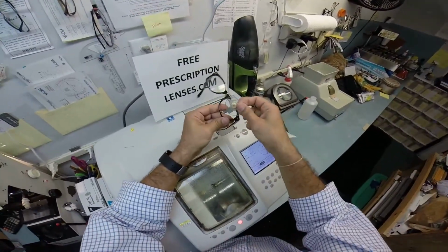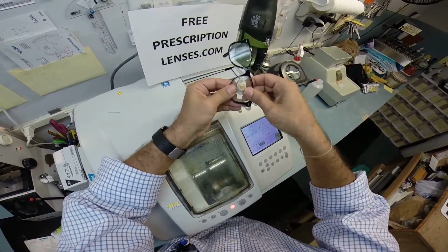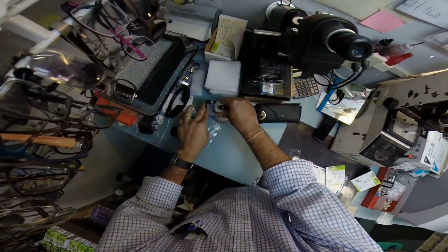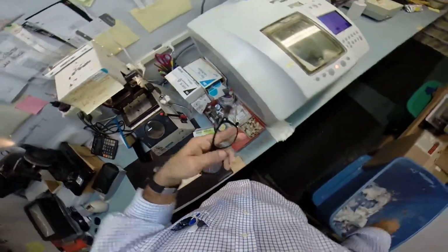So, I've rotated the frame around so the empty side is closest to me. I tuck the lenses in at the outside corner, then using the thumbs, I press down at the nose. And when that block's not there, it's much easier to do. So let's take this block off. Take that off, pull the sticker away.